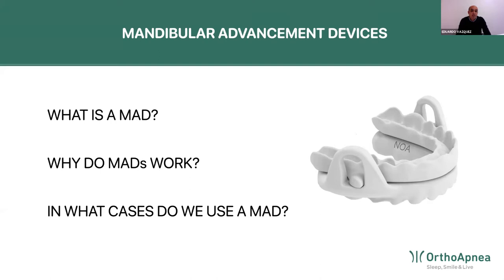But also MADs, as you know, can be used in patients that have severe sleep apnea that don't adapt to CPAP. And in these cases, the MADs can also be a good option for the treatment of the obstructive sleep apnea problem.